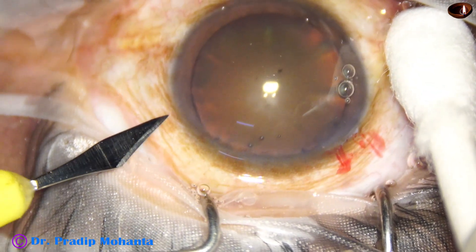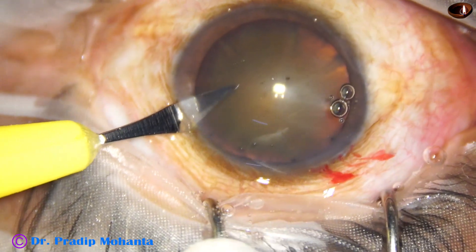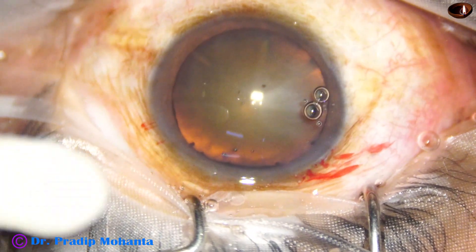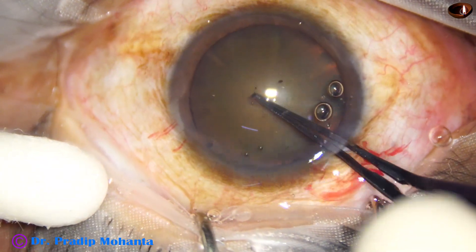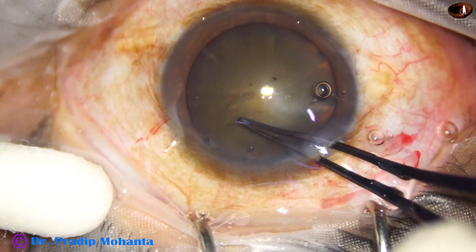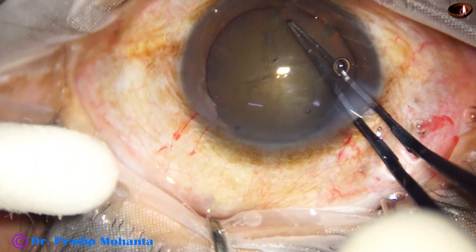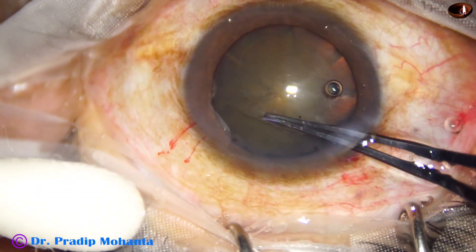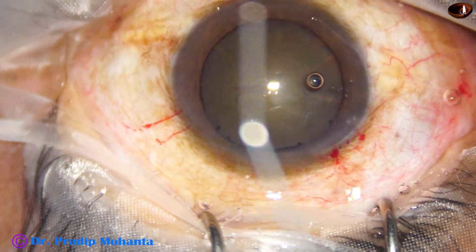A side port is made on the left side of the main incision with a lance-tip knife. Capsulorhexis is done with the help of Utrata forceps. The forceps pierces the center of the capsule and a capsular tag is raised. This capsular tag is guided anticlockwise all around to get an adequate sized rhexis of about 5.25 mm.